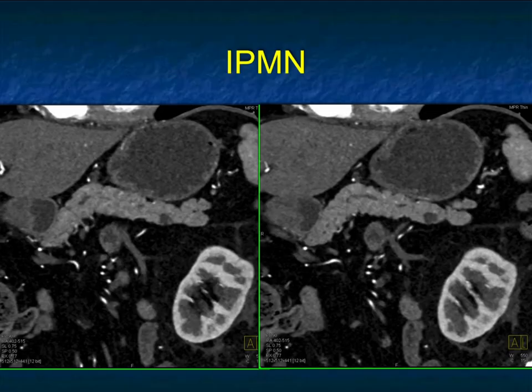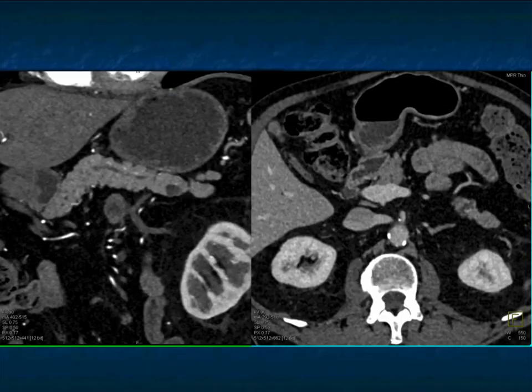Here's another example. You can see the pancreatic duct, and the lesion comes off the pancreatic duct. Again, it's about a centimeter in size — classic for IPMN. And again, this makes the point that the lesion is much easier to see on the coronal view rather than just the axial view.